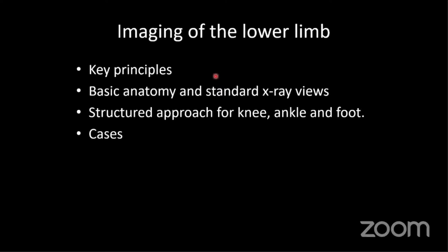Then I'll try and go through the principles and the structured approach and how you should be looking at these, with cases and examples to illustrate. I'll try and keep it as interactive as possible. I've got my eye on the chat, so if you have any questions, just type a message and I'll try and keep my eye out for that.